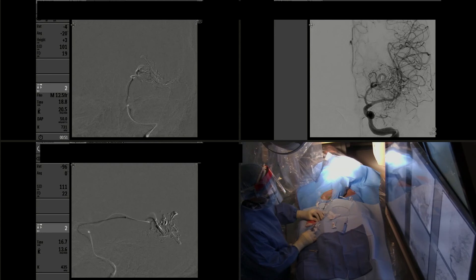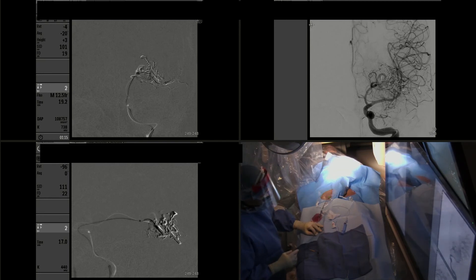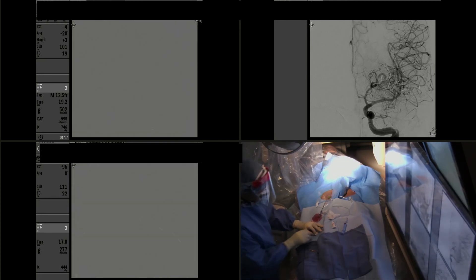You can see that now we're pulling the microcatheter out of the Onyx cast. We perform gentle traction to remove the microcatheter, but you see how the DAC, the intermediate catheter, has tracked over the microcatheter all the way distally into the middle cerebral artery. This gives us more support to pull the microcatheter. That was the main reason for using the distal access catheter as an intermediate catheter.